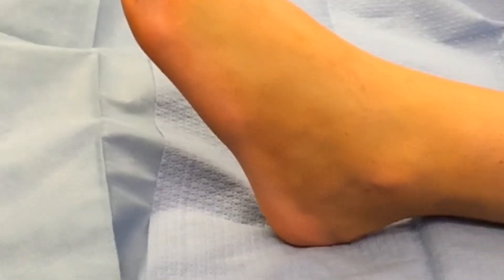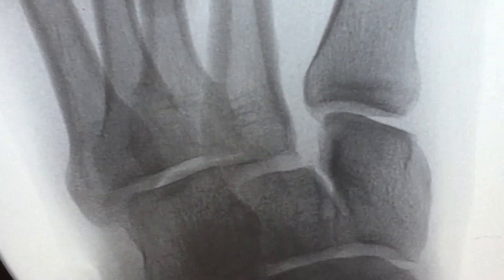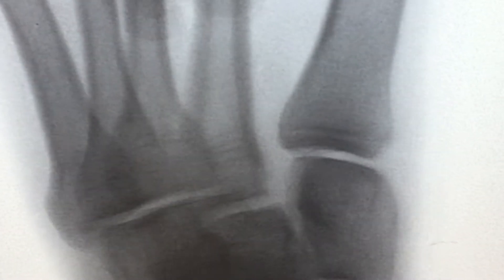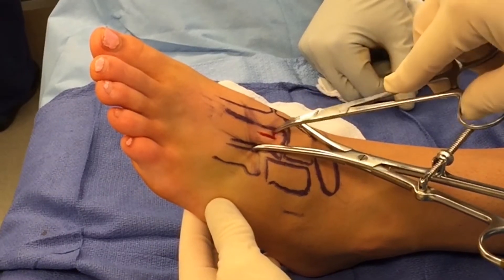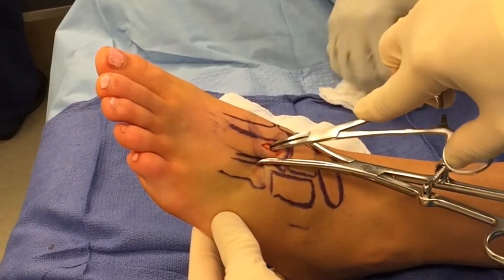Once the swelling is reduced, the patient is taken to the operating room and placed in a supine position with the foot facing straight up and down. Stress fluoroscopy is undertaken, confirming the instability of the Lisfranc construct and the diastasis between the second metatarsal base and the medial cuneiform. A small incision is made over the dorsum of the foot directed under fluoroscopy.